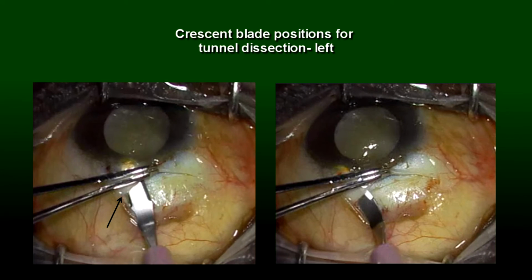One other thing, what do you notice about the position of the crescent relative to the curve of the radius of the sclera? What do you notice about that? Huh? Yes, you've got it. So there's three curves you have to pay attention to. There's the curve that's happening this way. There's the curve that's happening this way, and then there's the scleral curve that's this way.